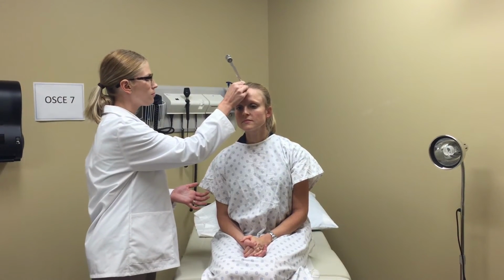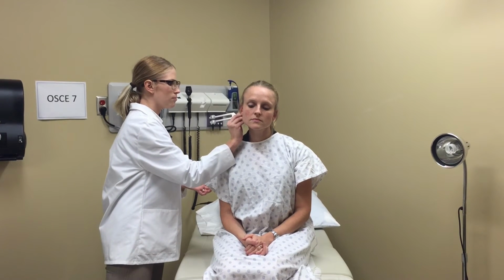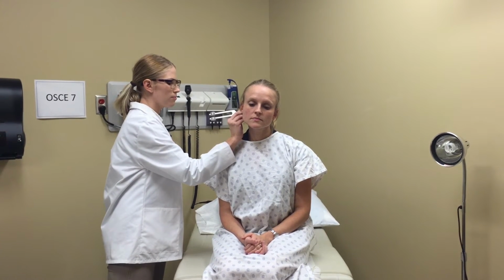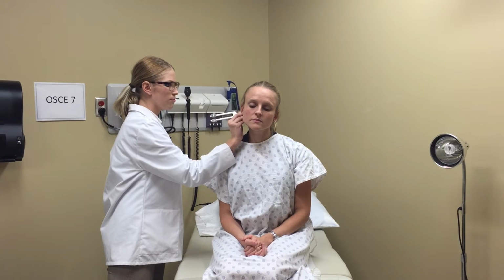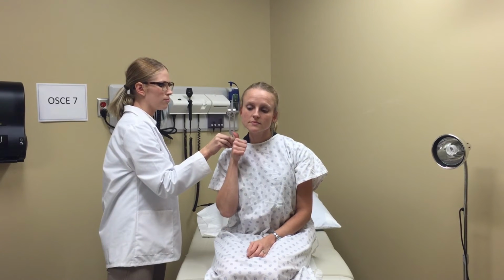The Weber test is next. We will hold our tuning fork by the stem and strike it before placing it on top of the patient's head, and ask the patient to report whether they hear a sound louder in one ear or equal. Next, the Rinne test will be performed, striking the tuning fork, holding it by the handle, and placing the stem of the tuning fork on the mastoid process. When the patient signals to the provider that the sound has stopped, the provider should quickly move the tuning fork to the external ear and ask if they can still hear the sound.